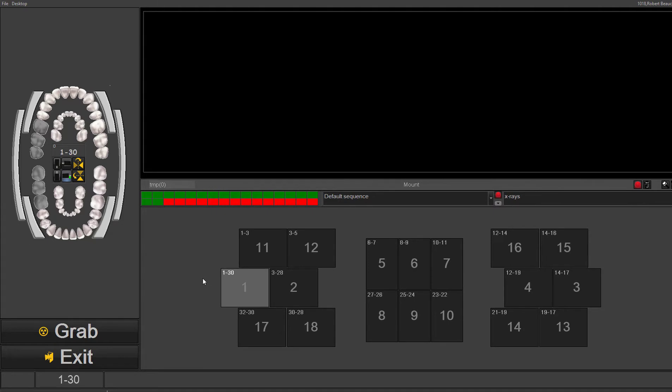Once here, the system will automatically use the default sequence. But what's great about the software is you can override the sequence at any time.